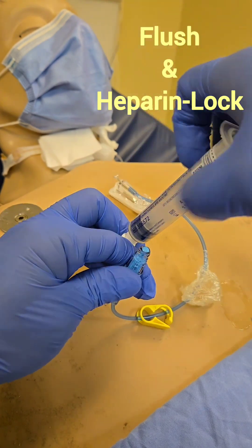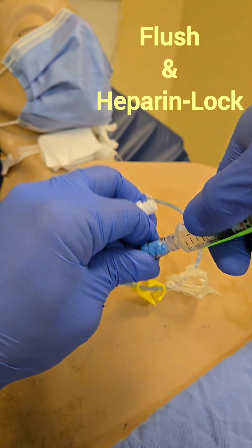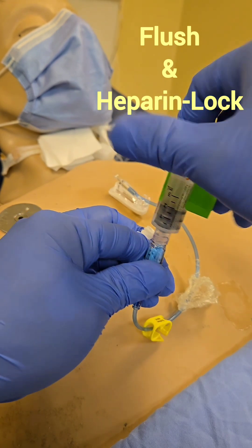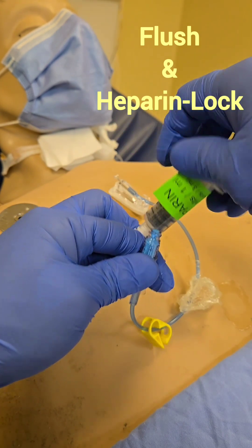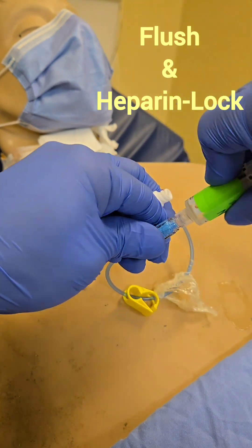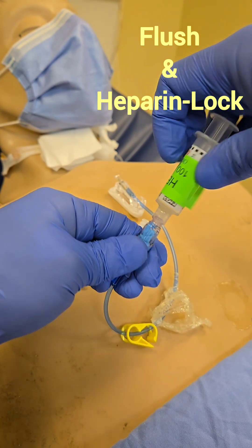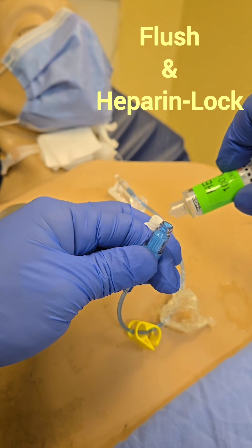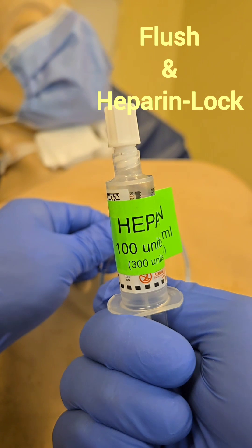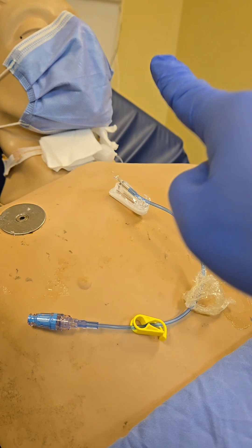Once flushed with saline, we're going to heparin lock it. For the heparin you don't need to push-pause — the heparin just needs to go straight in. Heparin will prevent any new clot from forming; once a clot has already formed, heparin becomes less effective. We're going to do 500 units — waste one cc — so 5 cc's or 500 units total, as per our institution. Always check with your institution for their specific requirements.